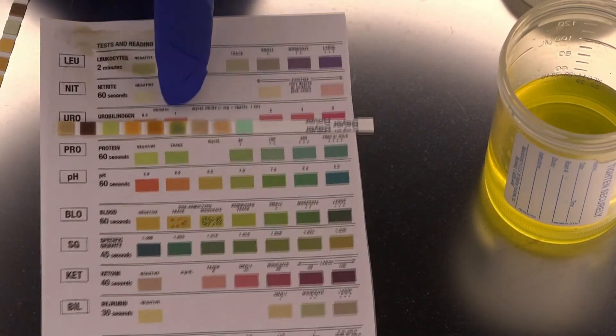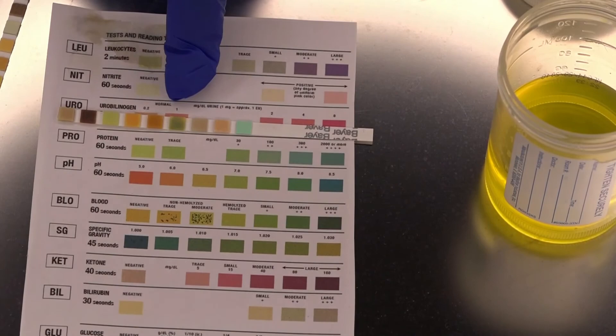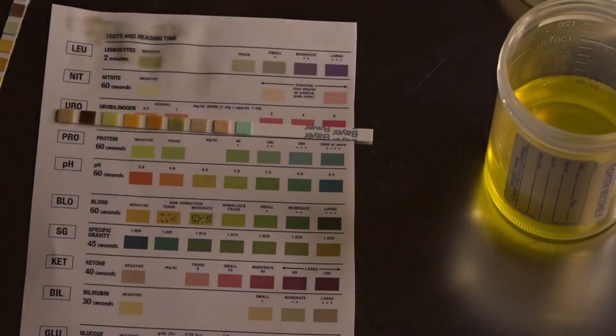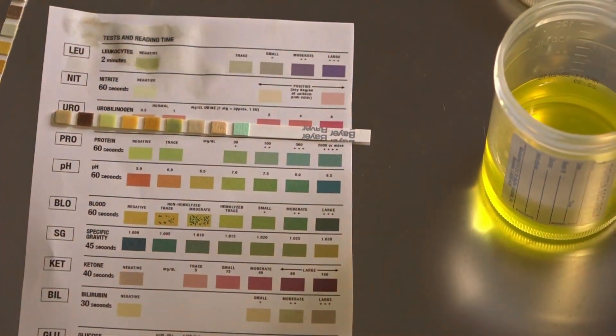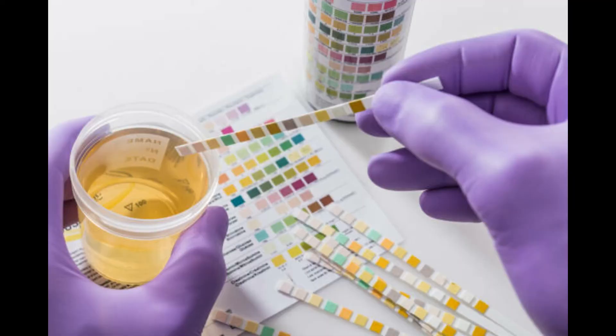After you interpret the results, you want to dispose of your urine per your facility's protocol, doff your gloves, and perform hand hygiene. And this wraps up our video on how to perform a urine dipstick, aka the urinalysis.